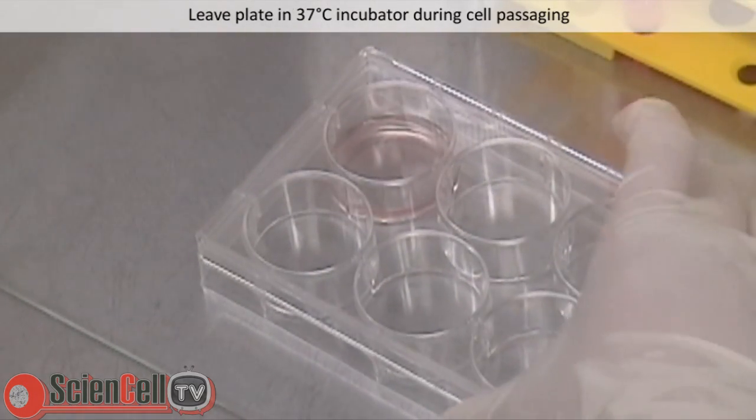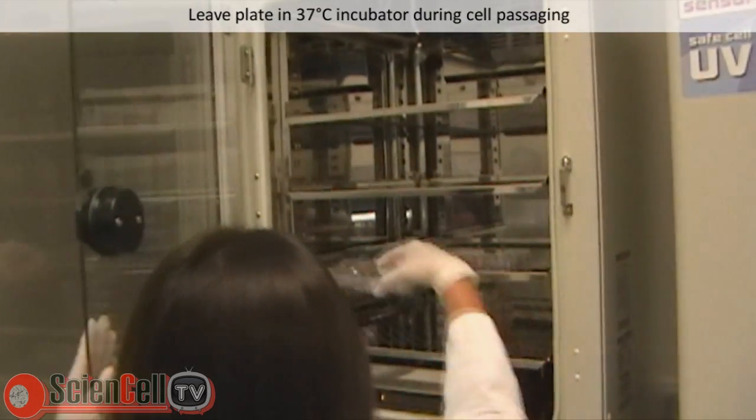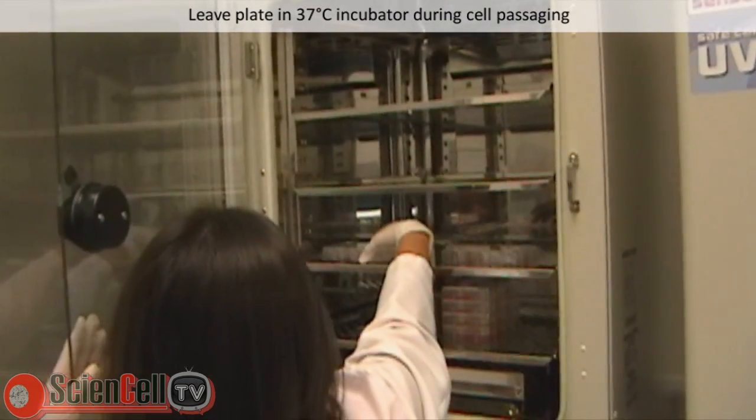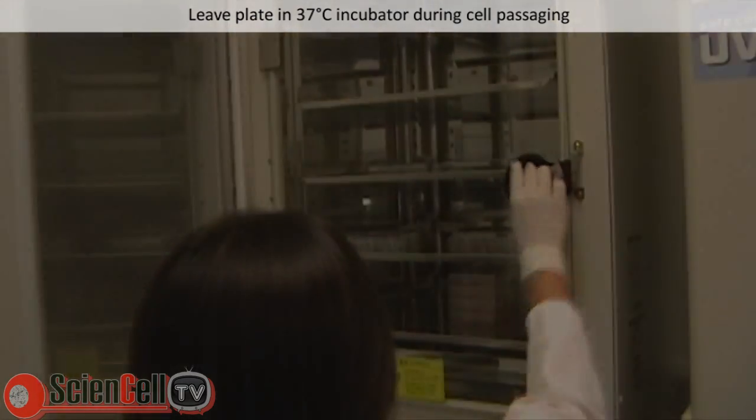The plate can be left in the 37 degrees Celsius incubator during cell passaging. For instructions on how to passage human pluripotent stem cells under feeder-free conditions, please see our online video library.